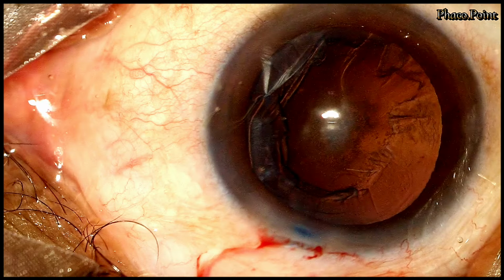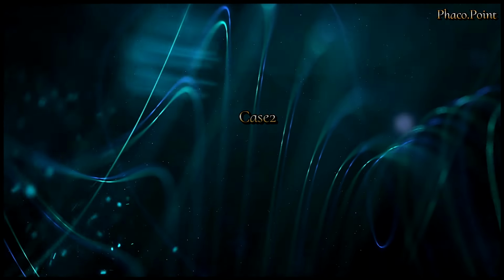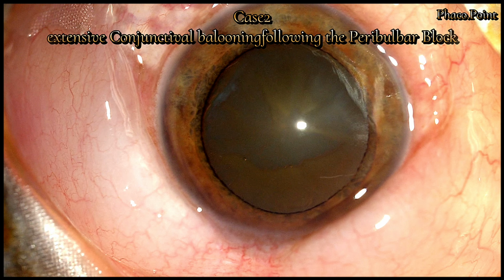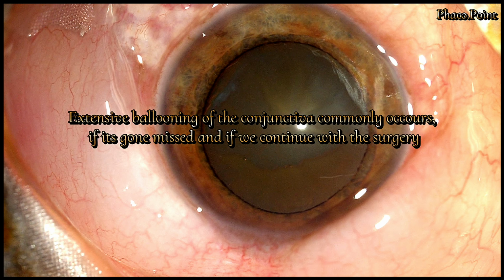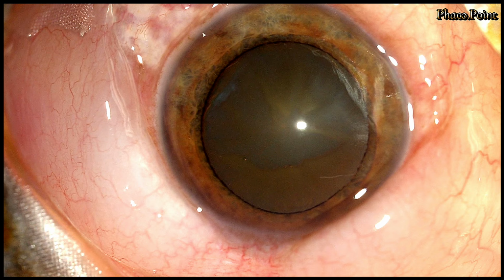As you can see, we've achieved a flattening of the conjunctiva, after which we are good to now proceed with the surgery, and you will find that no more conjunctival ballooning occurs even during the rest of the procedure. Let's now move to the second case. Here's a patient who had an extensive subconjunctival ballooning following the peribulbar block. This kind of picture can also be seen in a patient wherein the subconjunctival ballooning, when it starts to happen, goes missed and becomes rather extensive intraoperatively until finally it is noticed, and then we have to deal with it. Now let's see how we managed this extensive conjunctival ballooning.